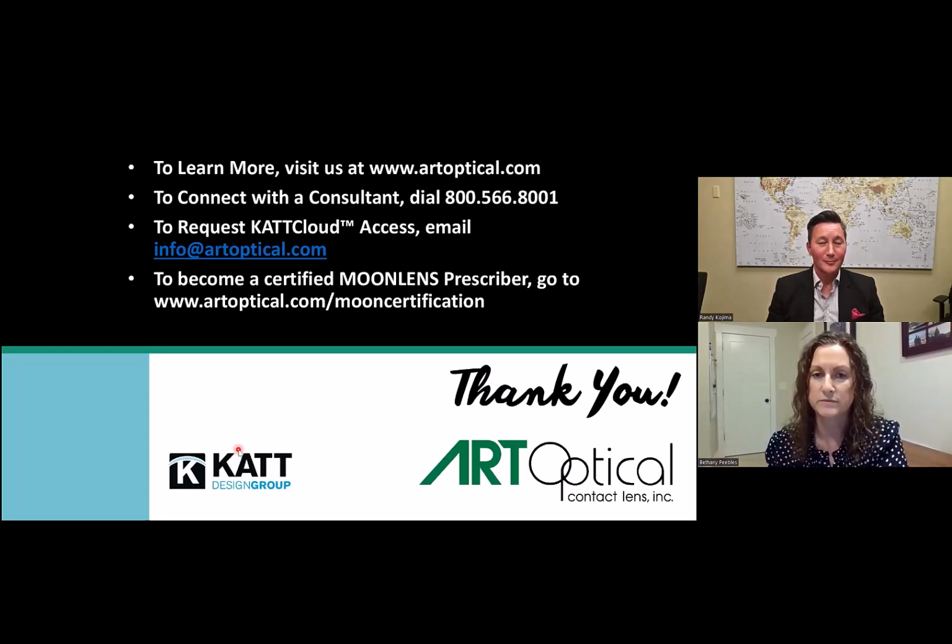So all good points. And I think having this platform is so helpful because there are so many moving parts. So if I want to flatten the base curve to maybe push a little more treatment, then we want to also make up for that by adjusting the RCD. These are things that we're thinking about from a consulting standpoint and may not readily come to mind as a new fitter or even an experienced fitter who might be new to MOONLENS. But what's great is the platform is going to do that thinking for you. You're going to put in that it's a frowny face, that I have a minus 75 residual, and it's going to make those adjustments for you.